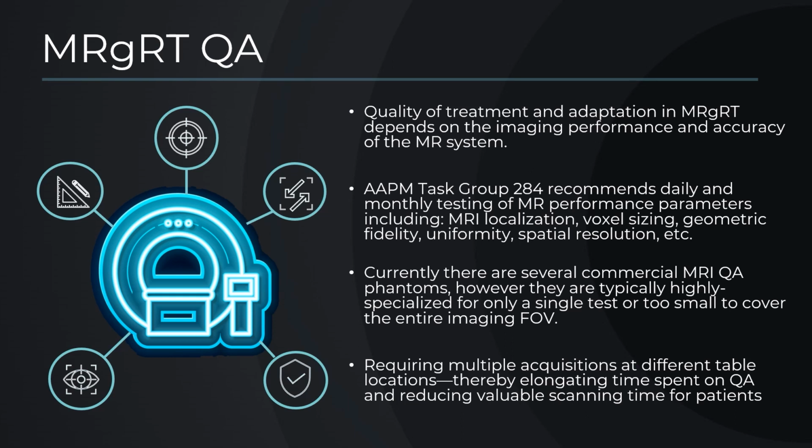However, it should be noted that although there are several image quality, geometric integrity, or even alignment phantoms that aid in the QA of these matters, many of them are highly specialized for a single or a limited number of tests, or they're limited in size, having a much smaller phantom volume than the actual imaging system's FOV.